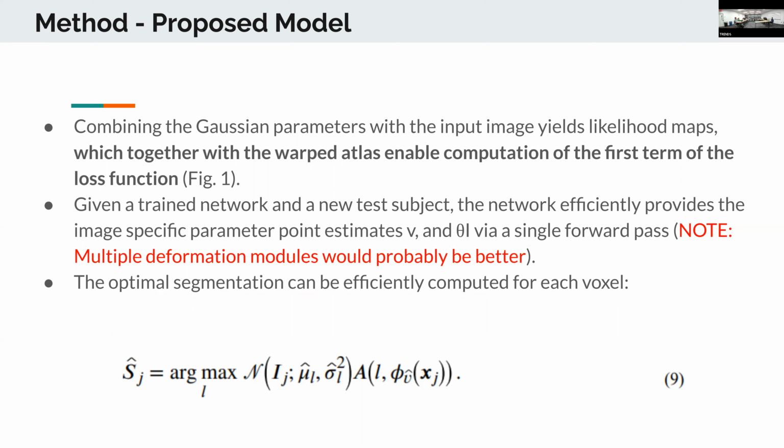Yeah, that's exactly right. For every voxel, those are both probabilities. One is the atlas weight, which is, let's call it a label, and the other is the sampled probability from there. And then when you multiply them together, you get the unnormalized posterior. Also, this is the objective function, basically. I mean, this is the important one, in my opinion. The other ones are just regularization terms. So this is the most important term, in my opinion. So A would be the prior, and this normal distribution, which is the bottom part of the thing, I think is the likelihood.